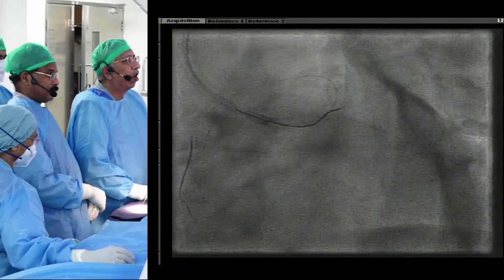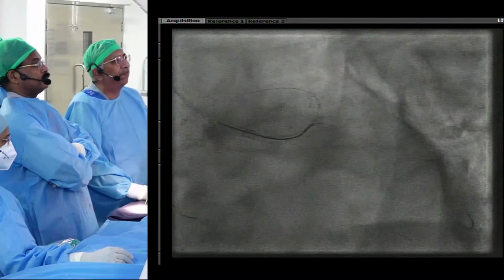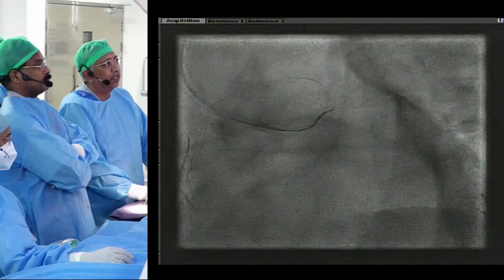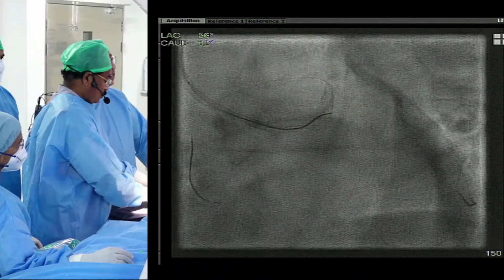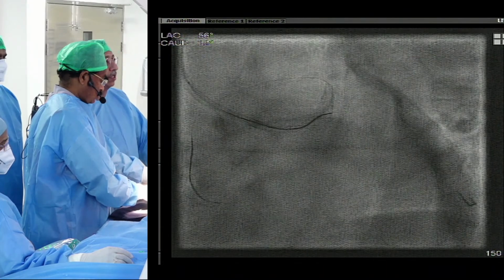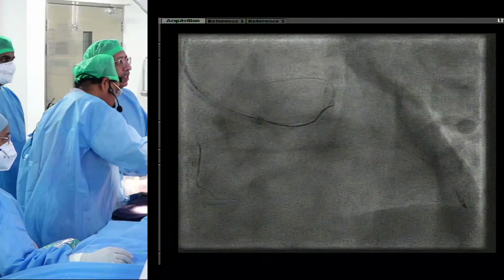No, it's going to be normal, but then I would go only by OCT in this situation because the iFR is going to be normal. There is no pinch. The issue is not whether there's a flow disturbance. The question is: is there a strut across the L-circ ostium? And if I can just cross this and then show you an OCT, I could decide on that.